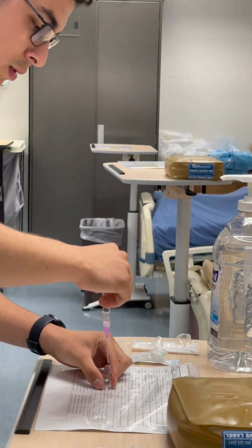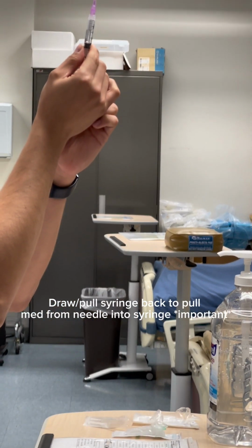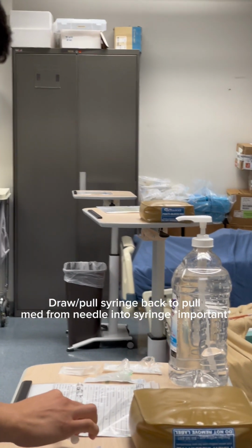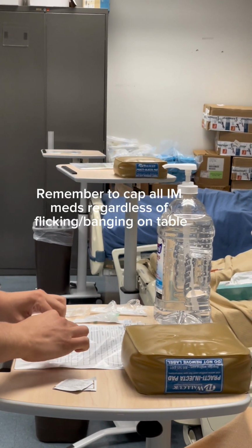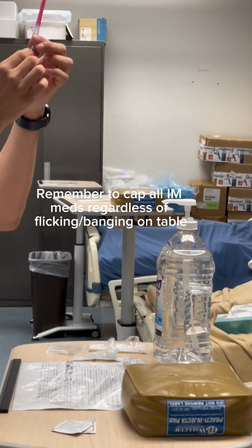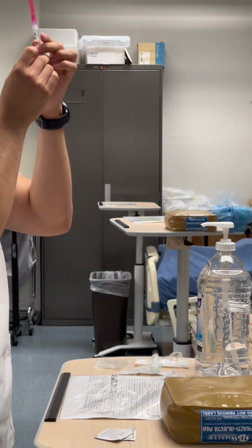I'm going to first draw. Going to scoop this using the scooping method. I'm just getting rid of any bubbles.